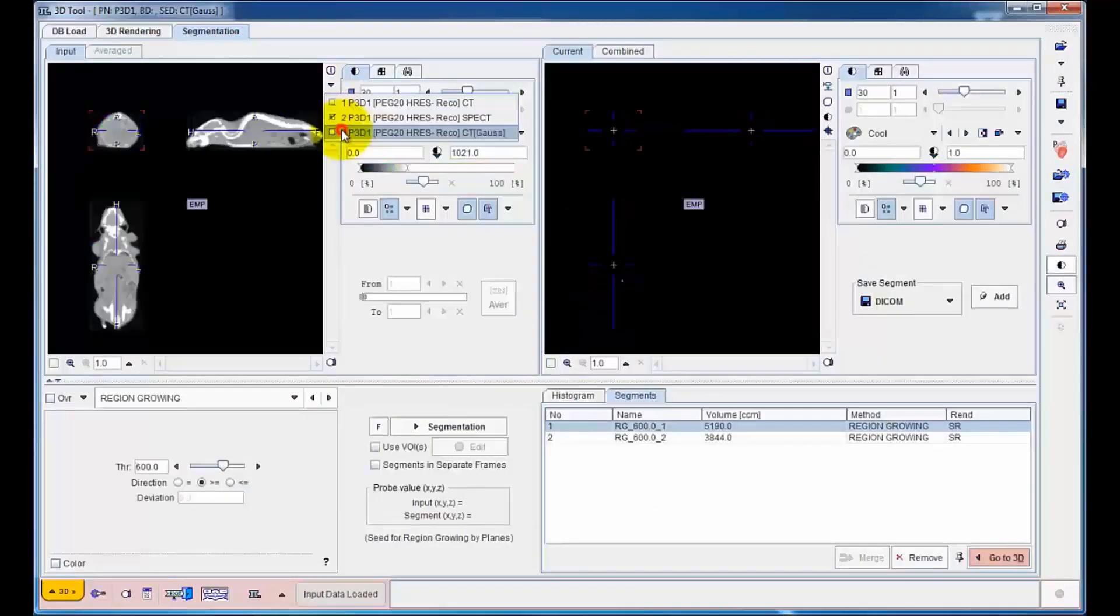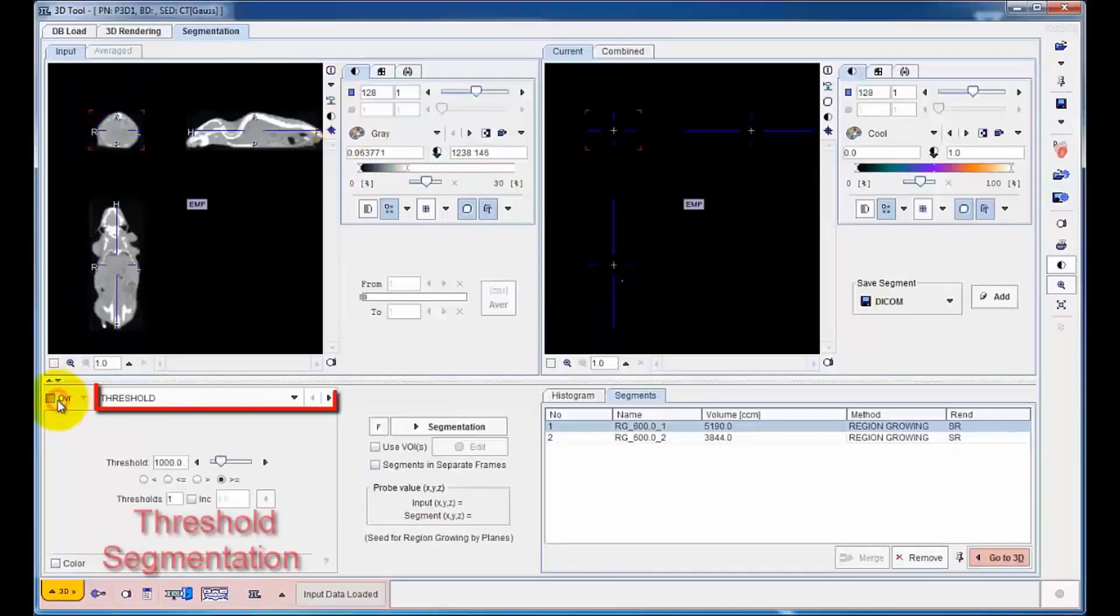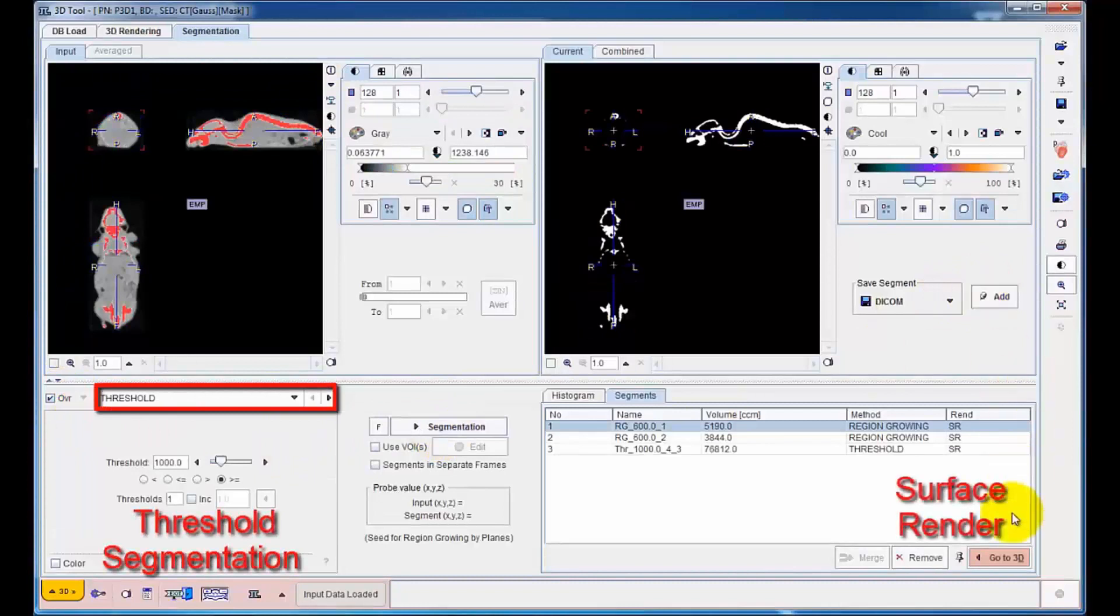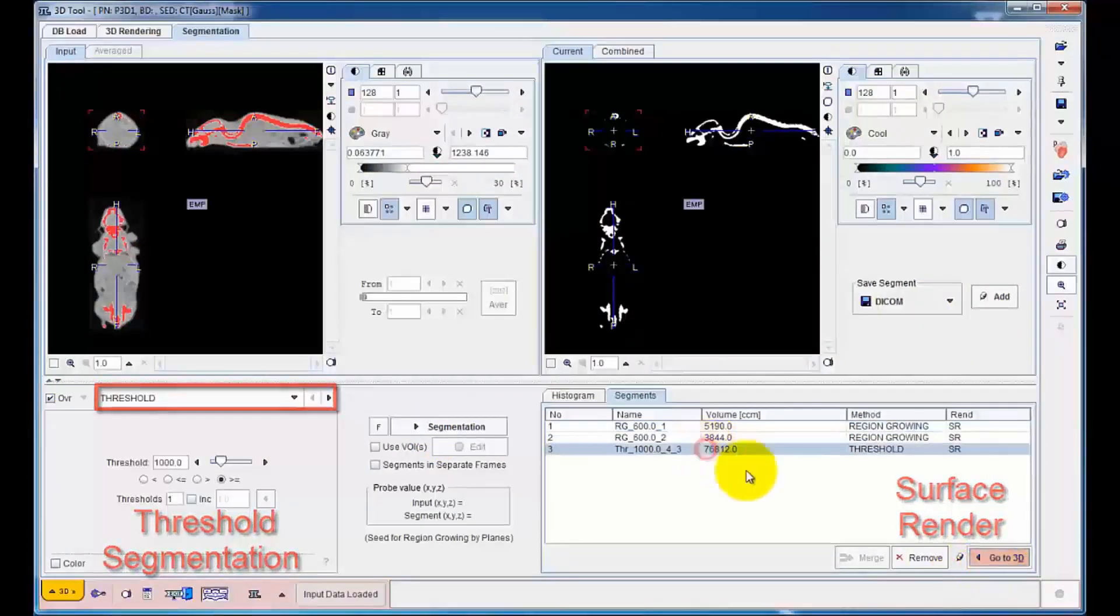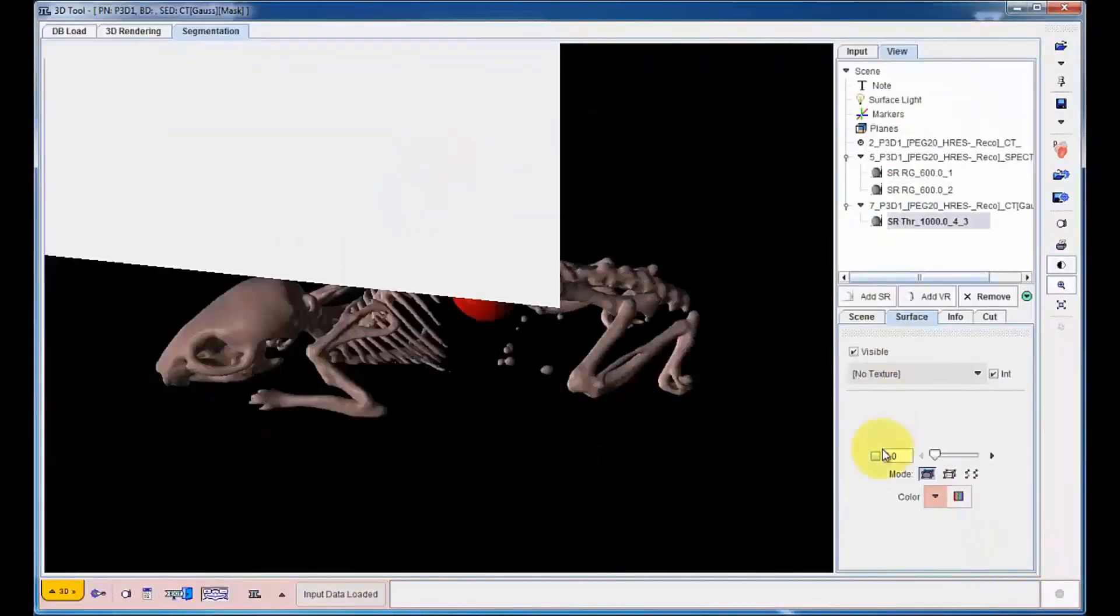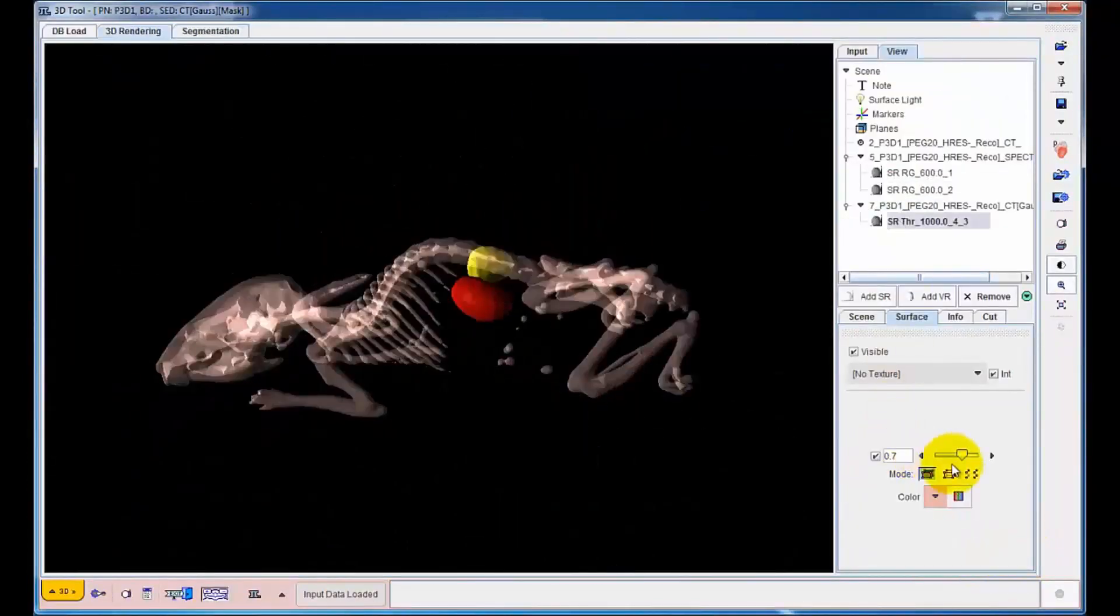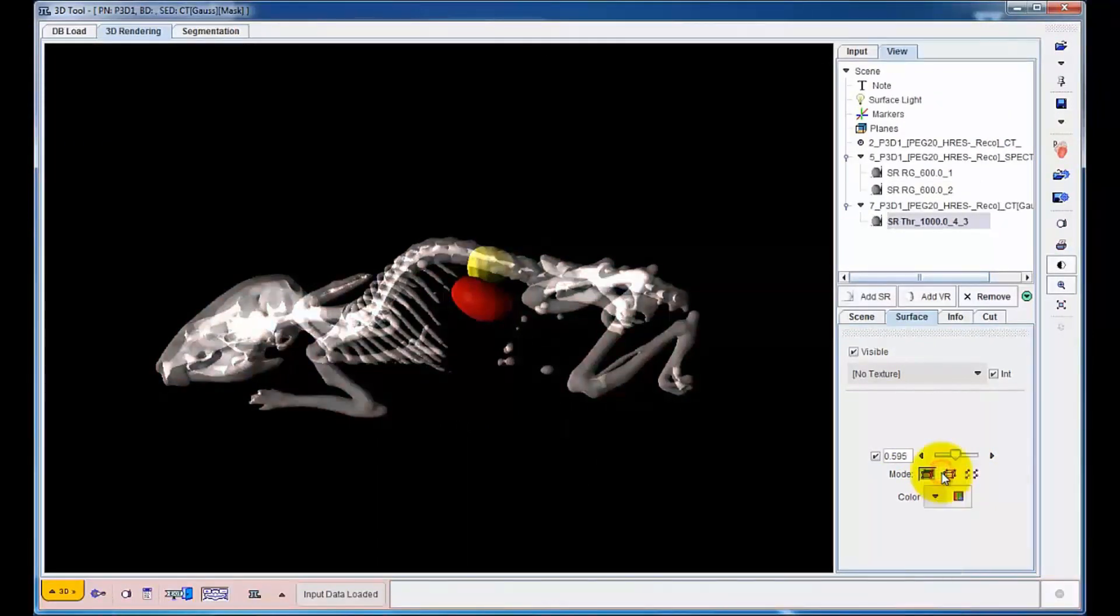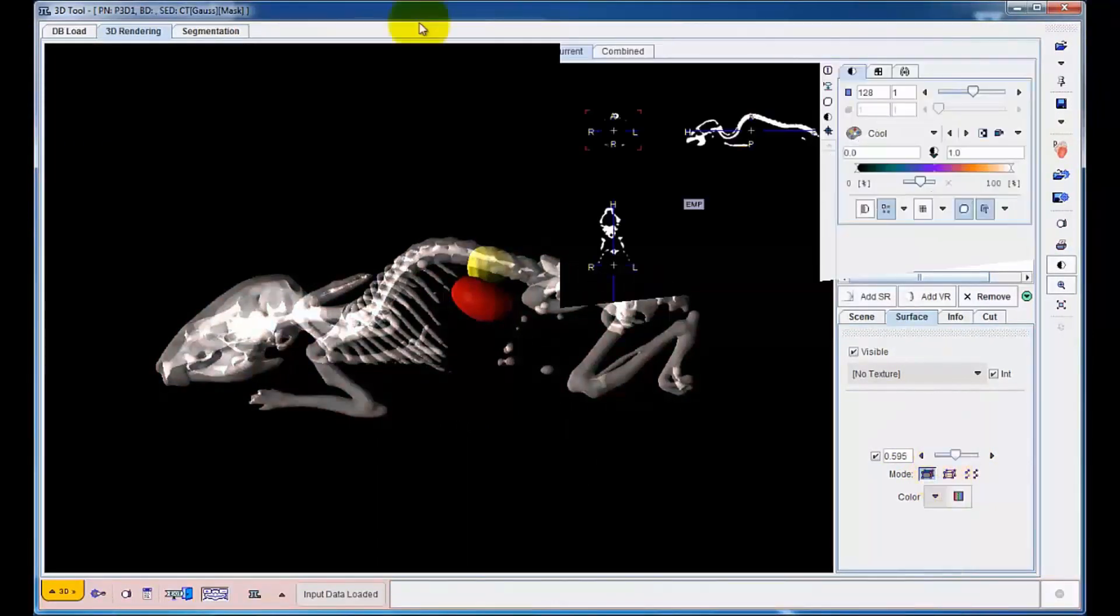The bony structures can easily be extracted from the CT image by simple thresholding. When this segment is surface rendered, the mouse skeleton is revealed.